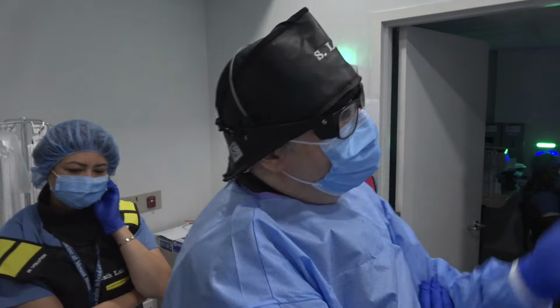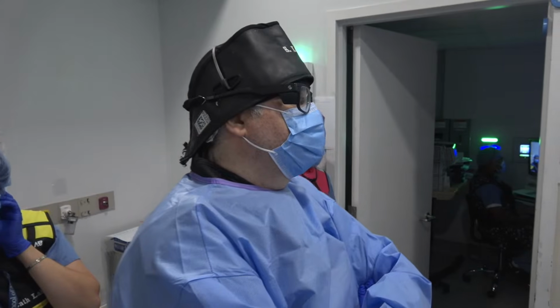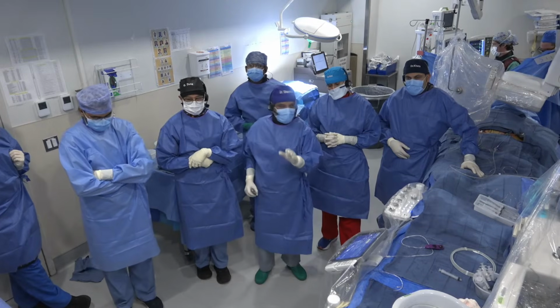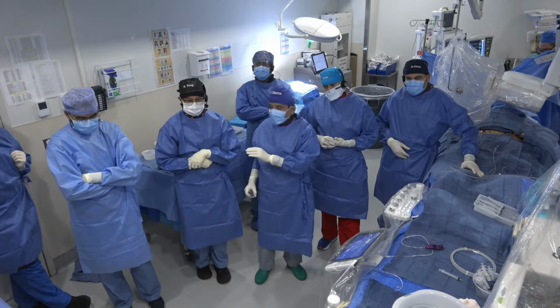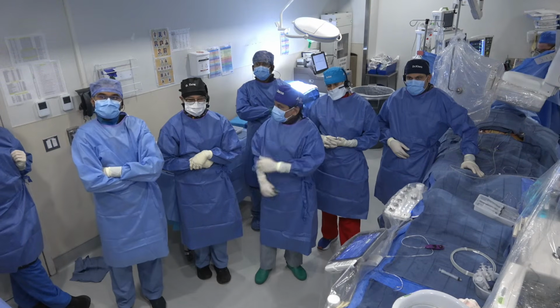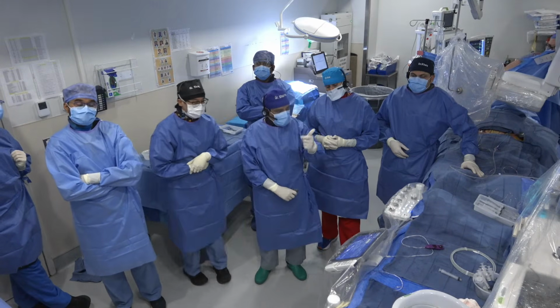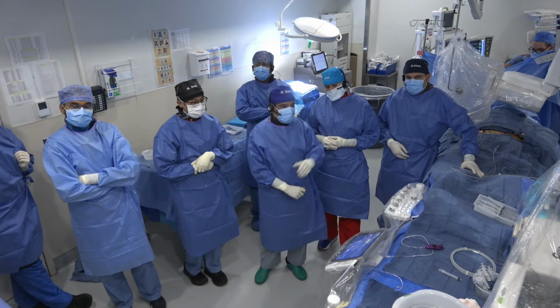Yeah, I would say that a TTE will not miss this kind of PVL. I saw the images, and after it became mild. No, I know, but it was not zero. No, what I meant is, it was not zero, it was mild, even on that day. The question was, could we have gone with a 26 True balloon? Well, we did a 24 True, then the ZMAT 25, and it is still mild. Could we have gone with a 26 True?